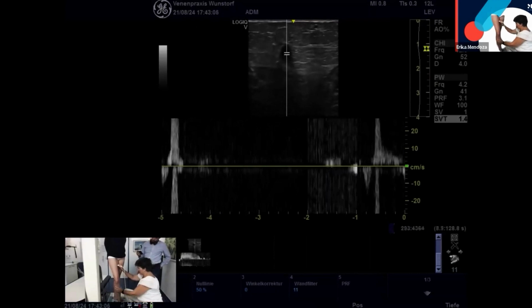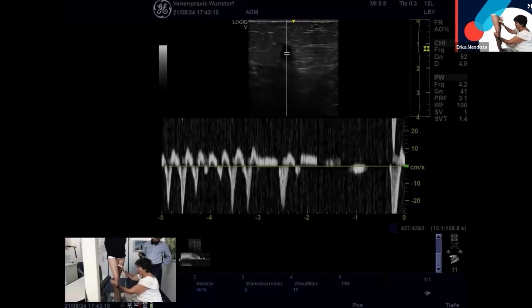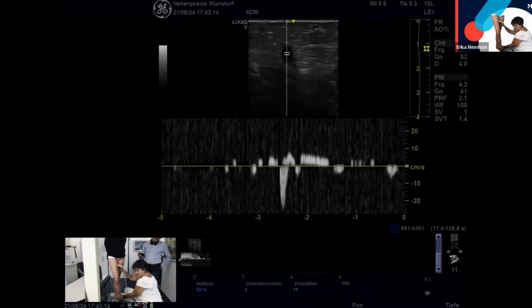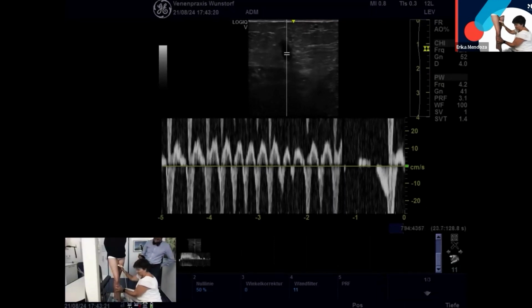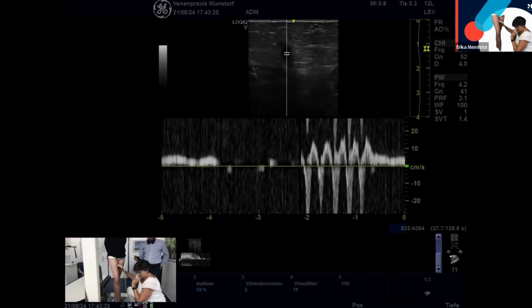This is the tipping maneuver. I like it. If I tip where there is no vein here, nothing. But if I tip on the vein, it is obvious that the vein I'm tipping is filled by the other one. And we can do another test.